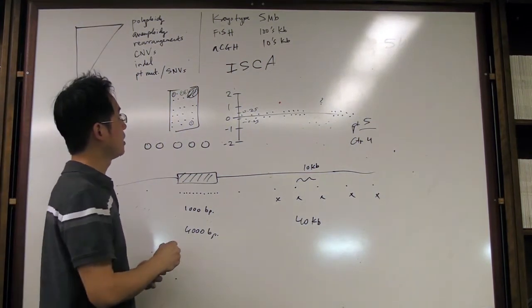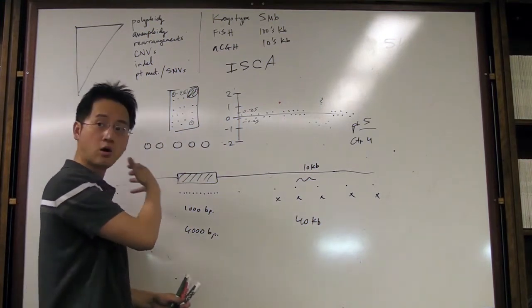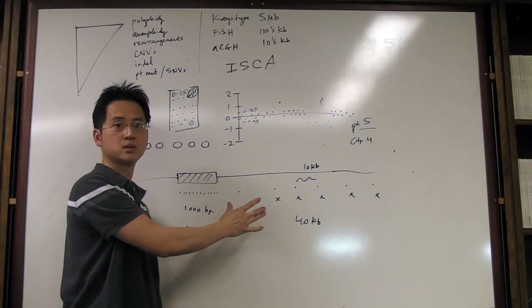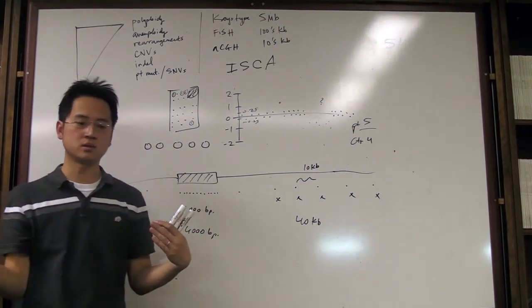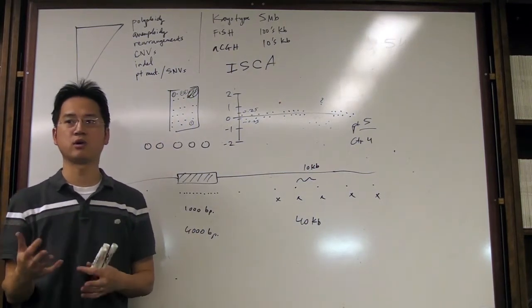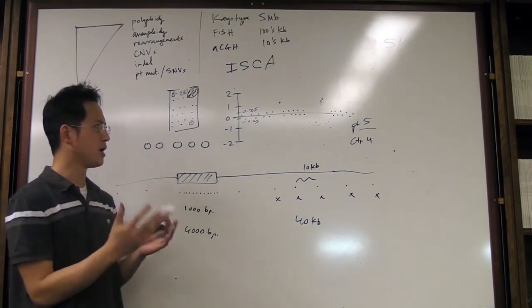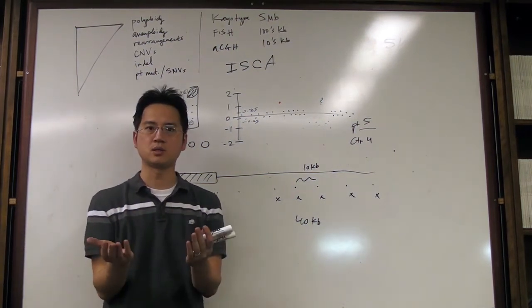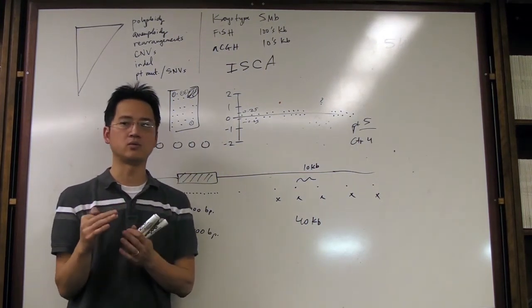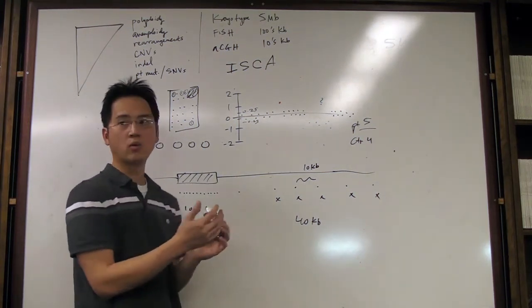So the advantage of array CGH compared to FISH is that now you get back to the whole genome coverage, right, genome-wide, as best as you can design your probes. So if you have 1 million spots on the array, or 2 million spots, you can make it very high resolution if you wanted to. But that's a very expensive chip. So we sacrifice resolution so that we can accommodate more patients, make it a relatively affordable assay per patient on the $300, $400 level. And therefore, we chose this 4x180K chip.